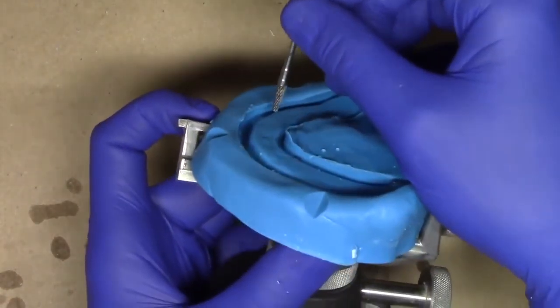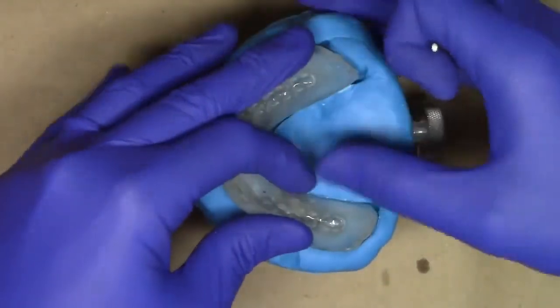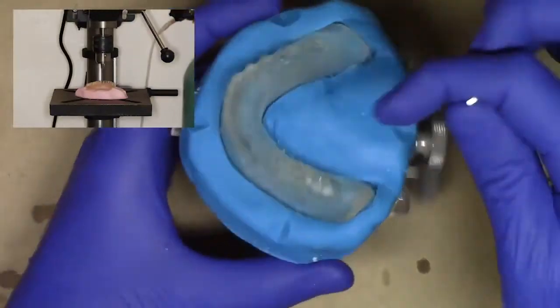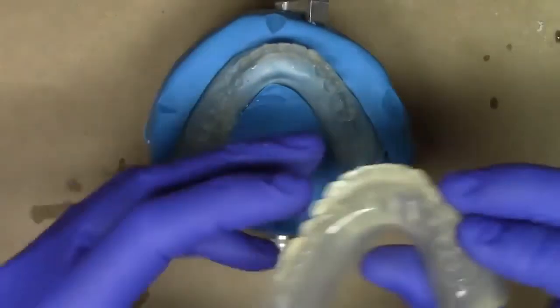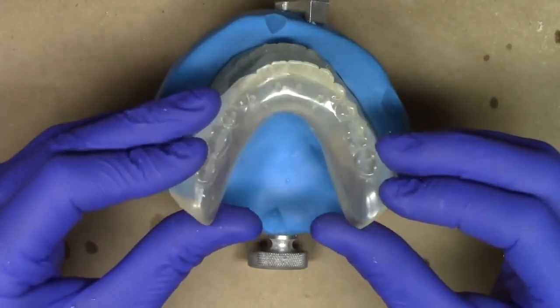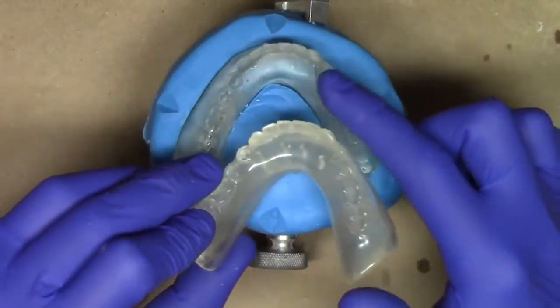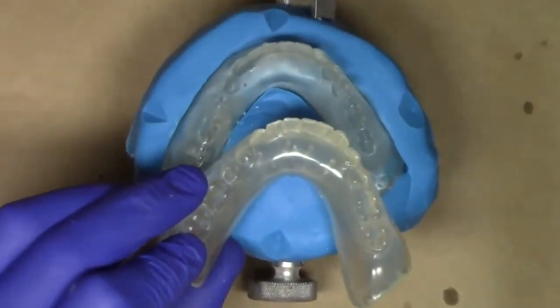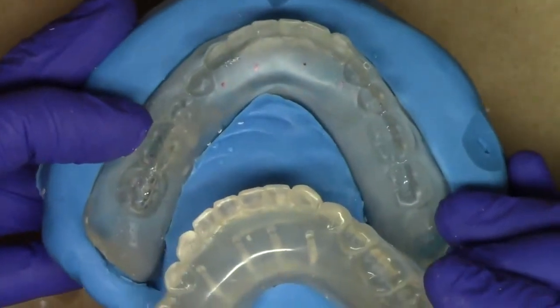I'm going to make sure that it fits without the denture as well as when the denture is present. That's going to give me this type of orientation where you can see 1, 2, 3, 4 holes in comparison to where we were before. And right in here.